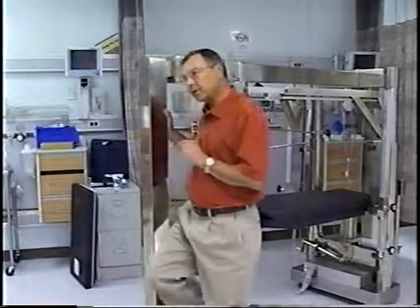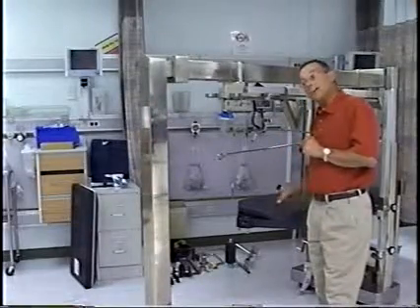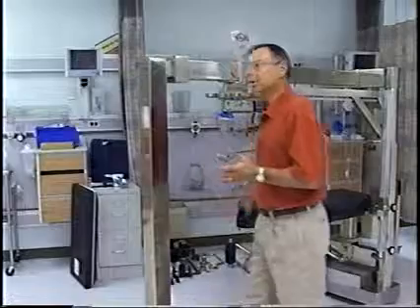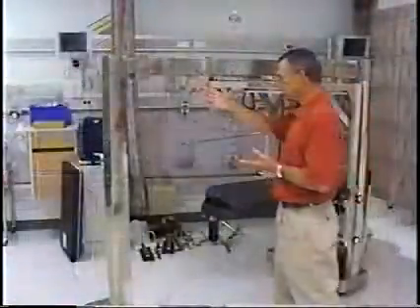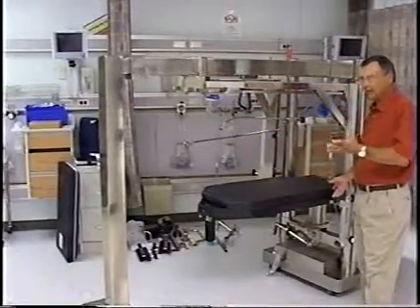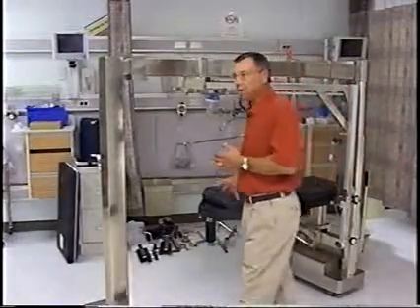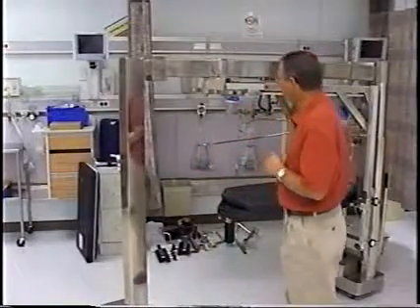Again, 90% of the procedures that you're going to be doing on any fracture table, including this one, and by the way, probably the majority of your surgeons, if they're over 45 years old, trained on this table or a variation of it. This is an older Chick table. It's probably 20 years old. We upgraded this table about, what, Pat, nine years ago? Yeah, seven or eight years ago, something like that. We upgraded it to what we call the IOT, the Imageable Orthopedic Table. And we'll talk about that in a little while.